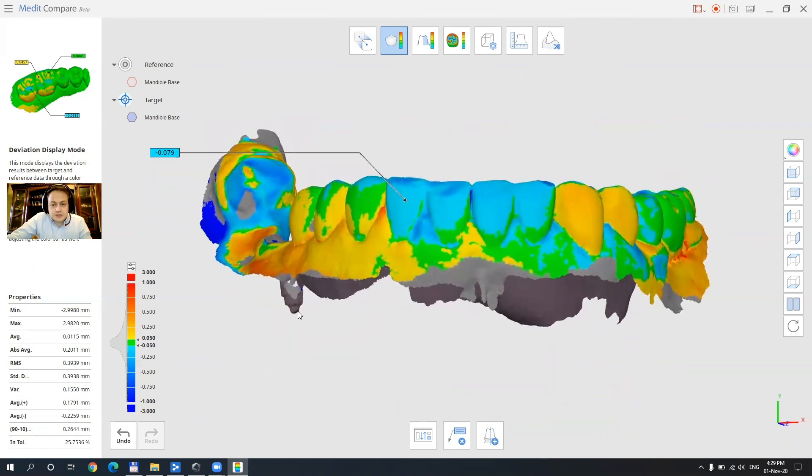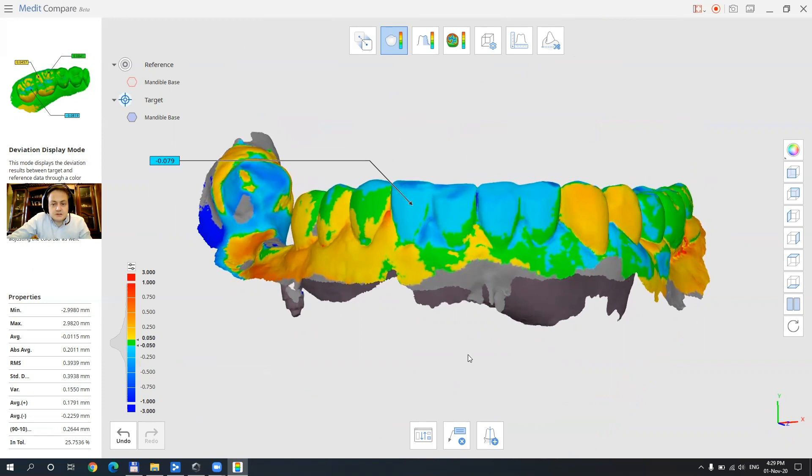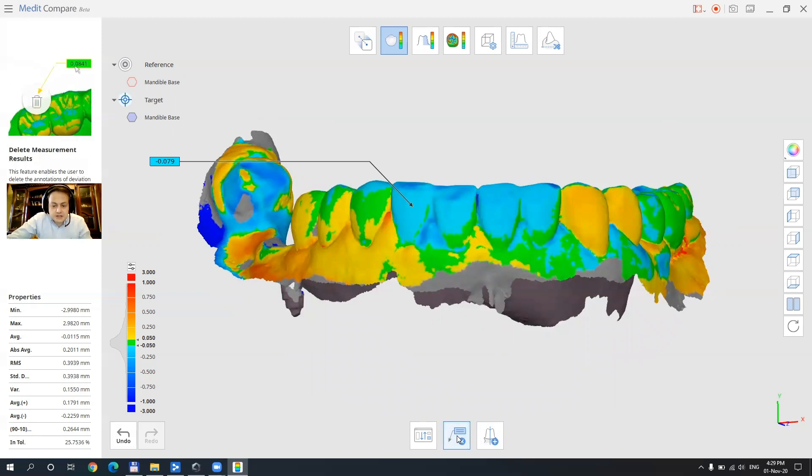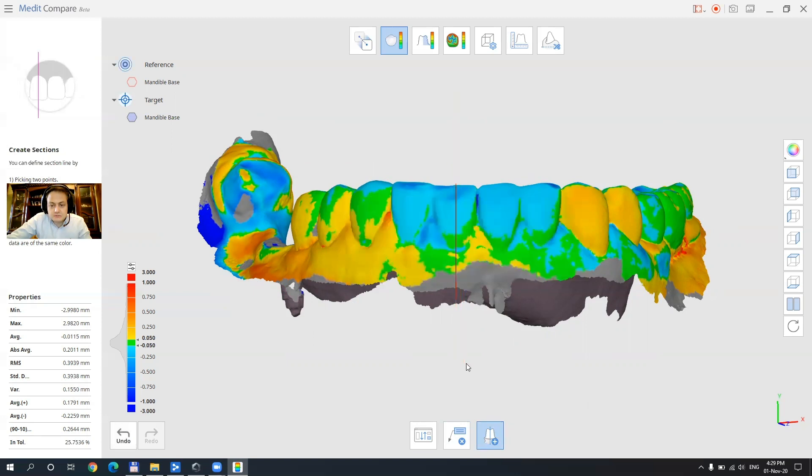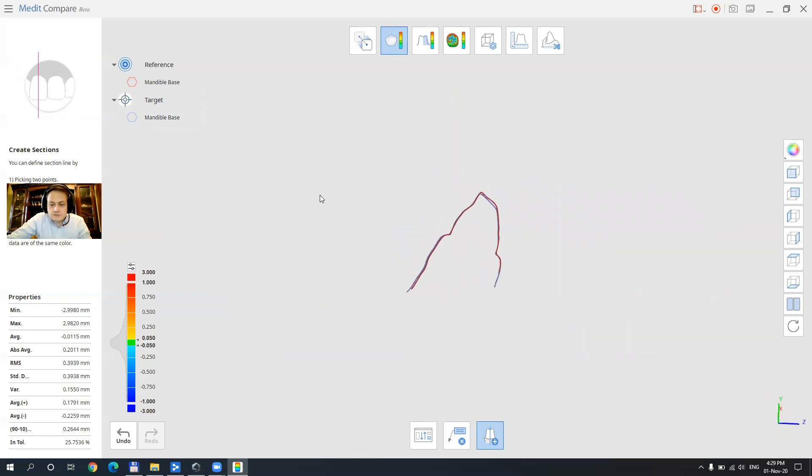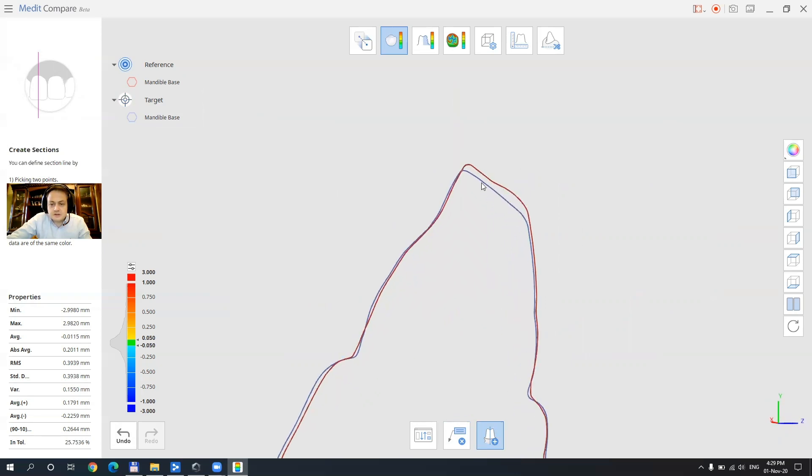We have to take in account that also there are discrepancies between the scans as well given by the different moments the scanner was doing the full arch. Okay by clicking the remove button we can also remove the measurements that we've done. We can also do a cross section. After doing the cross section then disabling the models will be able to also have a better visual of what happened and we see that the incisal vestibular area got smaller due to abrasion.